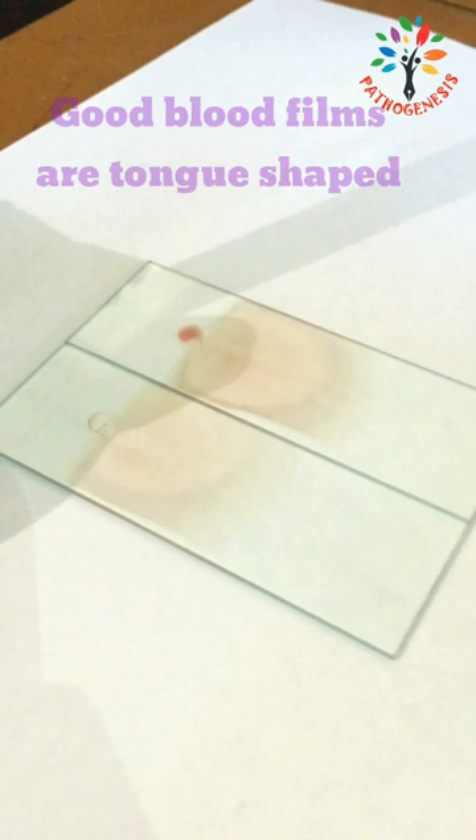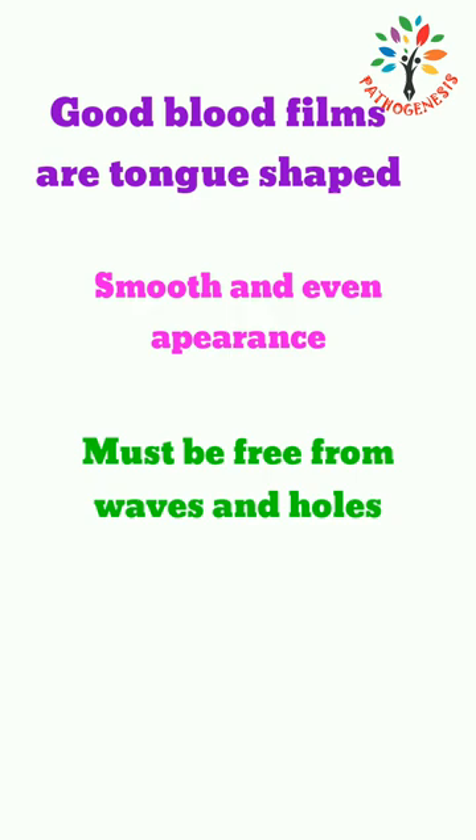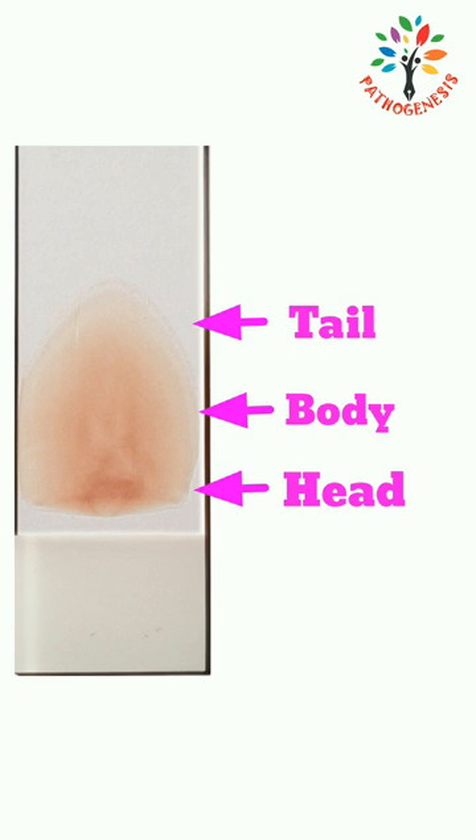Good blood films are tongue shaped, having a smooth and even appearance. They must be free from webs and holes and should not cover the entire surface of the slide. A peripheral blood film consists of three parts: head, body, and tail.